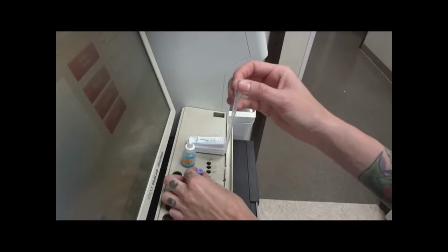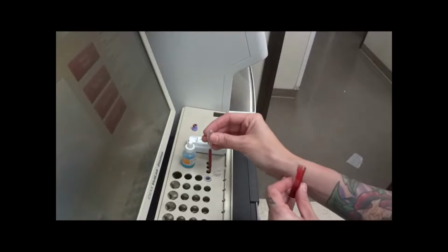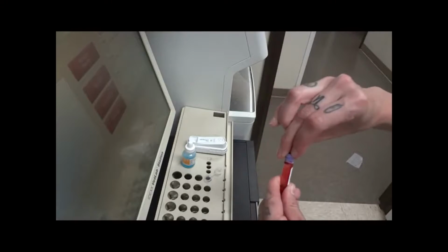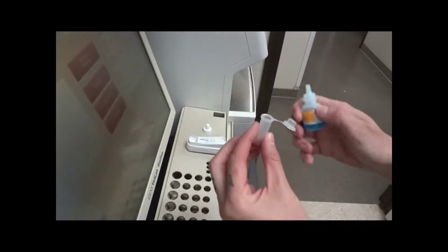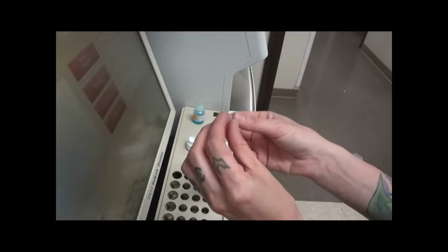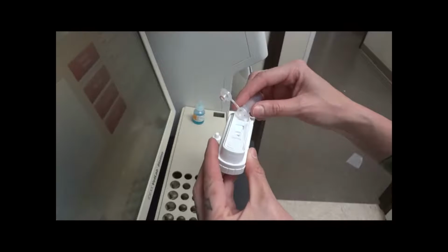We've got our pipette, which we'll use to take 3 drops of whole blood and place into our mixing tube. And then we will place 4 drops of the conjugate into the same tube. Invert the tube a couple times so that it's mixed well. Place the mixture of conjugate and blood into our snap test.